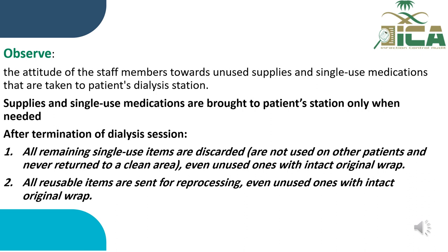After termination of dialysis sessions, number one, all remaining single-use items are discarded, even unused ones with intact original wrap. Number two, all reusable items are sent for reprocessing, even unused ones with intact original wrap.